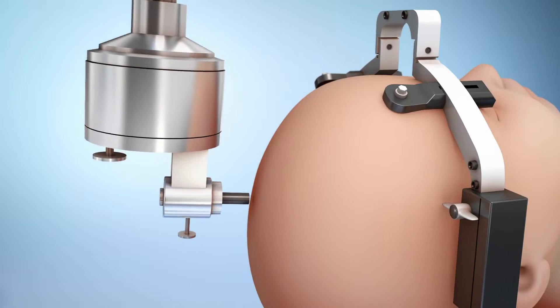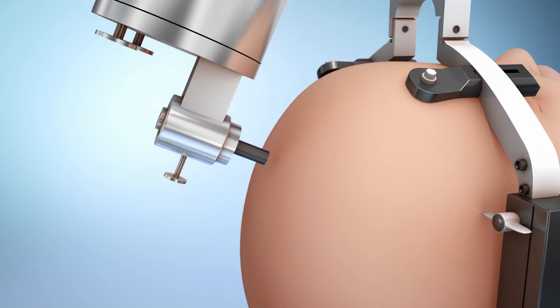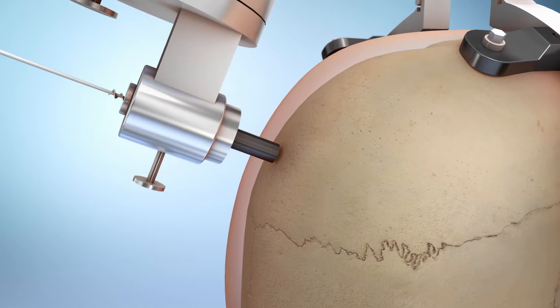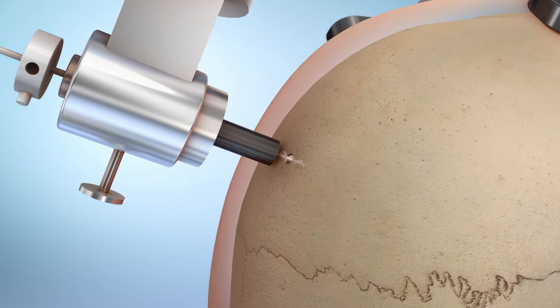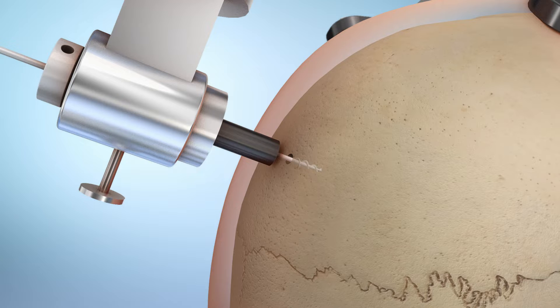Next, the robot will move to the precise spot to place the first electrode. Using the robot arm as a guide, the surgeon will make a tiny hole in the skull.